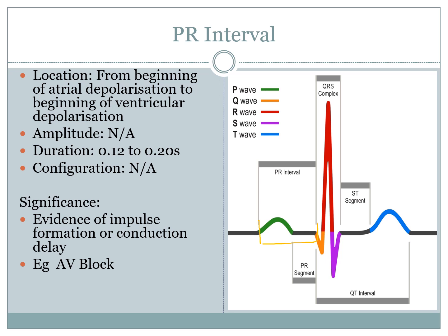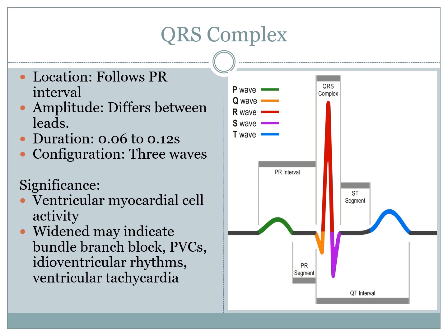When we move to the QRS complex, that is your ventricles depolarizing. Okay, so this is the main muscle depolarizing, which means we have the biggest amplitude. The biggest amount of millivolts will be released during the myocardial depolarization because it's the largest muscle mass within the heart. Okay, normal is anywhere between 1.5 squares and 3 squares. Now I'm talking little squares, obviously, when I say squares. So it's quite thin because it's a very quick depolarization, very quick peak.